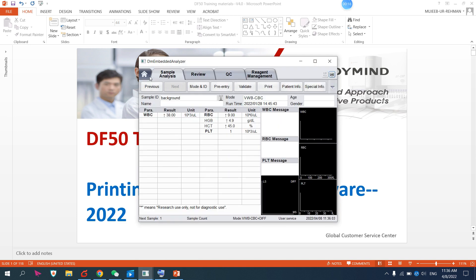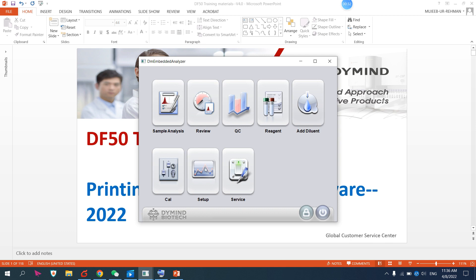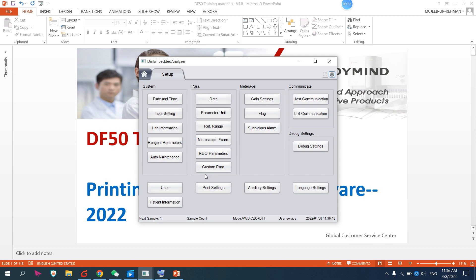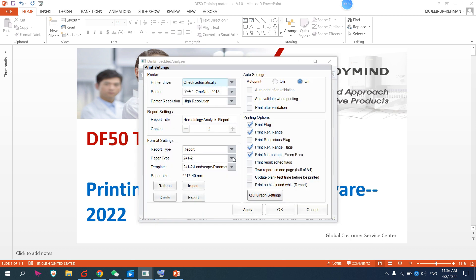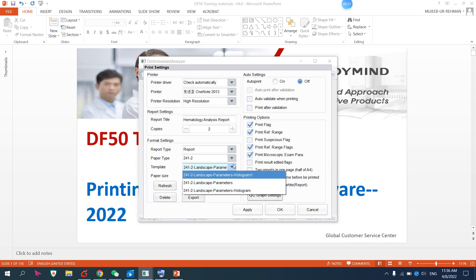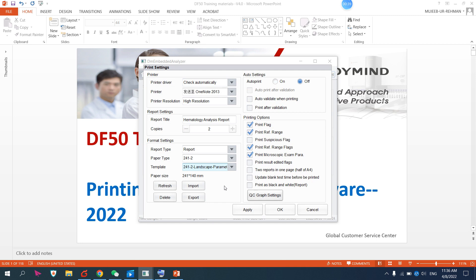This is my DF50 demo software. First, you need to connect your USB flash drive with the DF50 analyzer. When you connect the USB through the flash port, you have to go to Setup and then Print Setting. Here, choose the file you want to export, then use this option to export to USB.